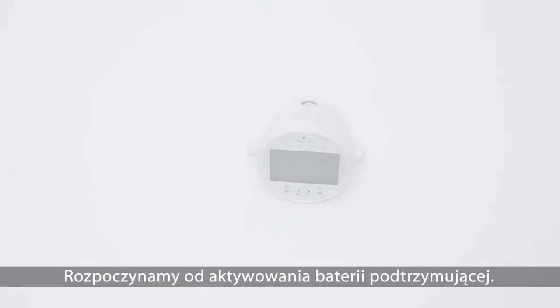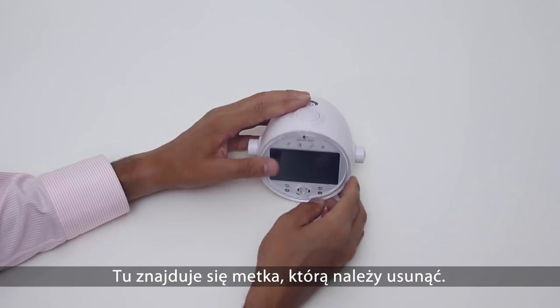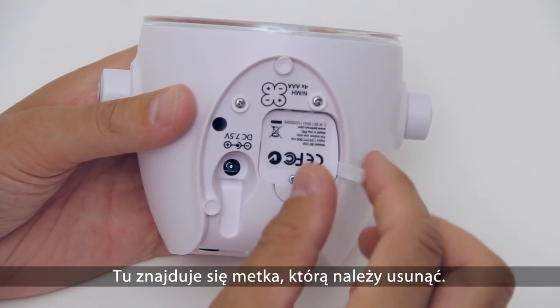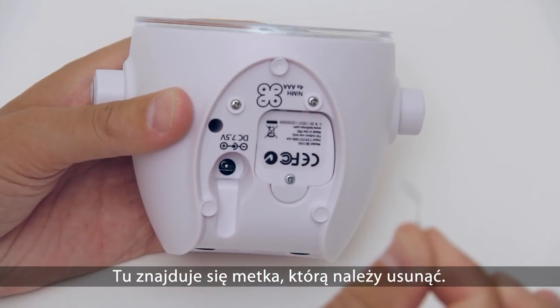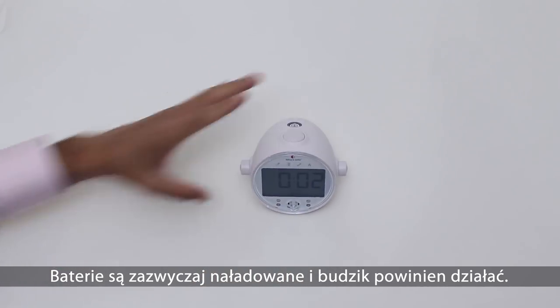The first thing you need to do is to activate the backup batteries. You will find the battery tag here. Now remove it by pulling it straight out. The batteries are normally charged, and the clock will now be up and running.